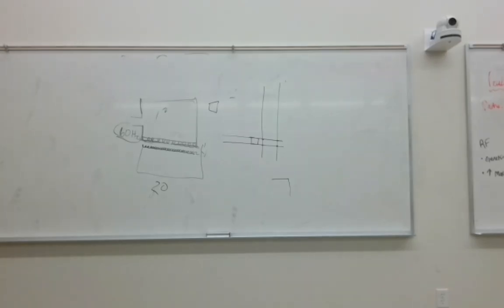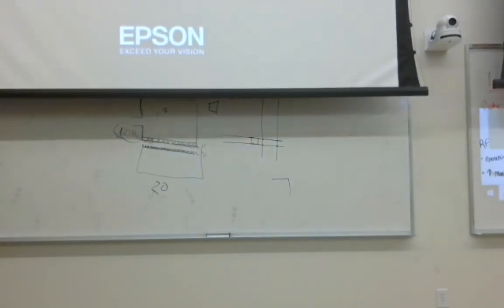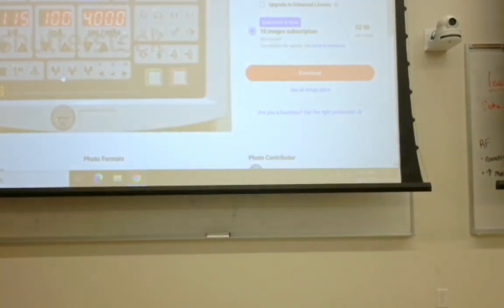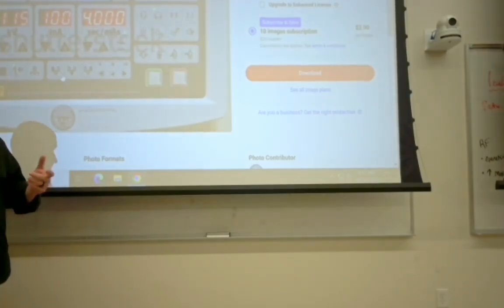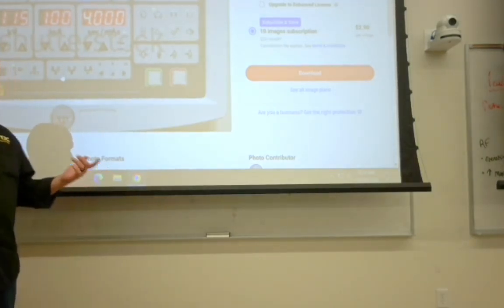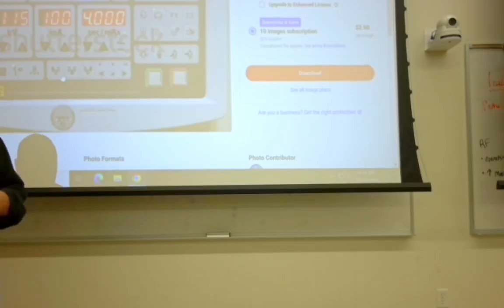Okay, so this is about as basic of a control panel as what I can find. What are components on this is far more basic than what you probably see in clinicals. Most of the time in clinicals and our modern machinery, you push a button that corresponds to the image that you want to create. So you're taking an X-ray of a chest, you push the chest button. You want to make an image of a hand, you push the hand button, right? But this is pretty bare bones.